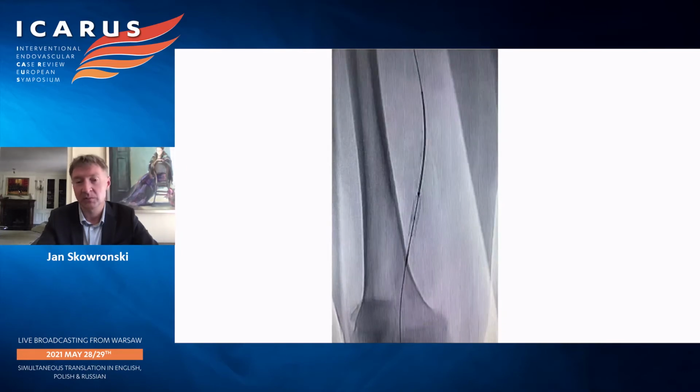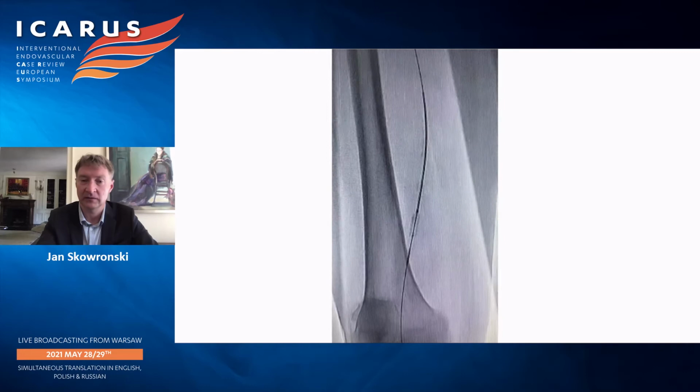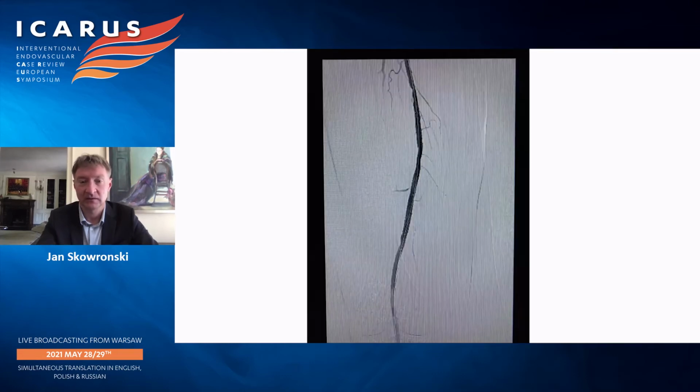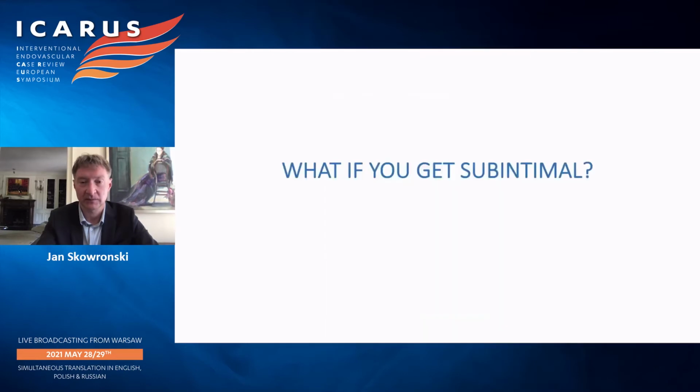This is just deployment of an Eluvia stent from Boston Scientific. We have actually used a lot of Eluvias over the last 2 years. I think the data on Eluvia is actually real, and the rate of restenosis is really extremely low. I find it less than 10% over 2 years from what I have seen. So this is just the final result of the treatment.